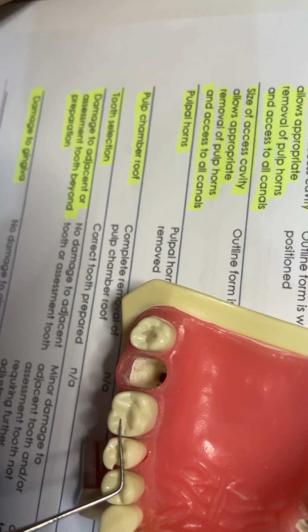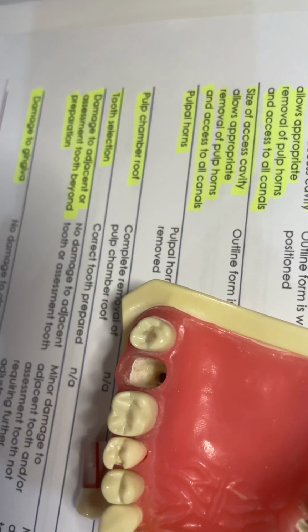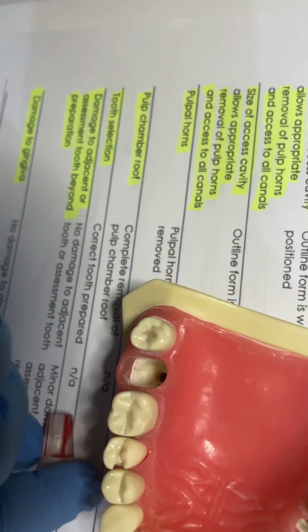So mesial cusp, in between the cusp tip and the central groove. And if you look at the palatal cusp, when you look at the cusp tip, the palatal canal is located just at the cusp tip area.